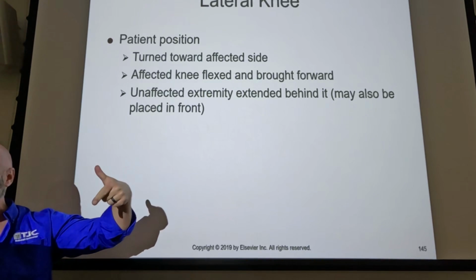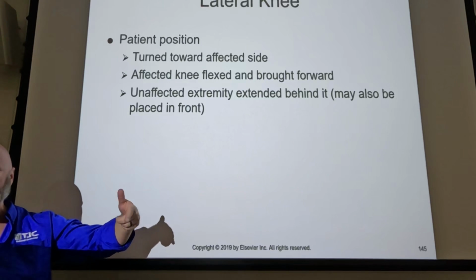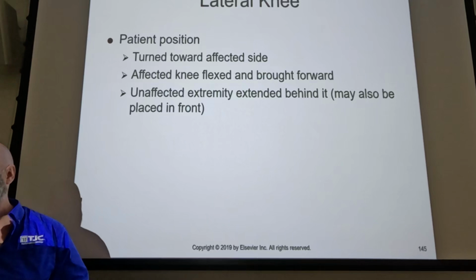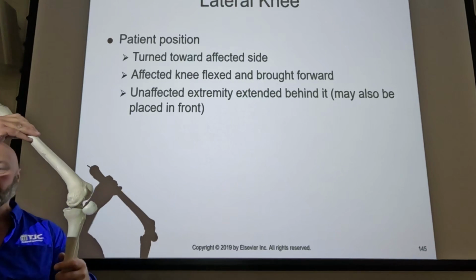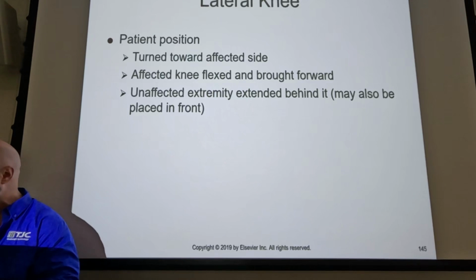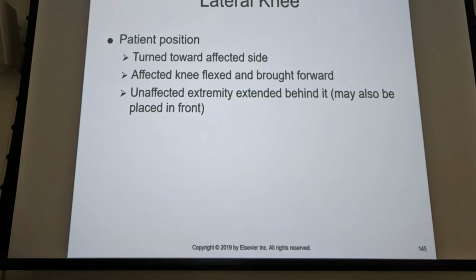So maximization of the volumization is what it's talking about. All right? So 20 to 30 degrees gives you the most joint space. Okay? Don't bend more than that, don't bend less than that. So rotate towards the affected side, bend the knee 20 to 30 degrees.